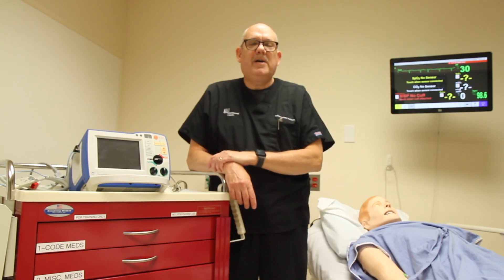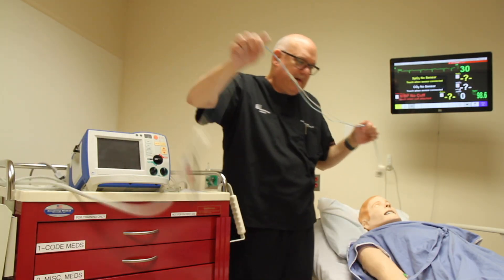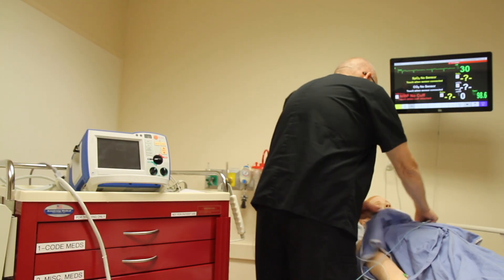The process begins with attaching the hands-free cables. Using the diagram on the pads package or on the cable connectors themselves, attach them to the patient's chest wall.